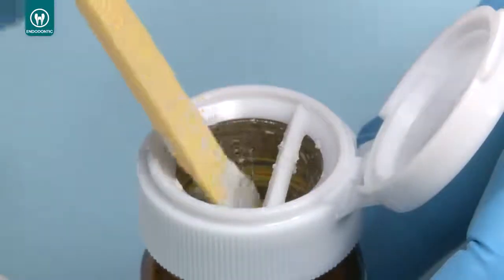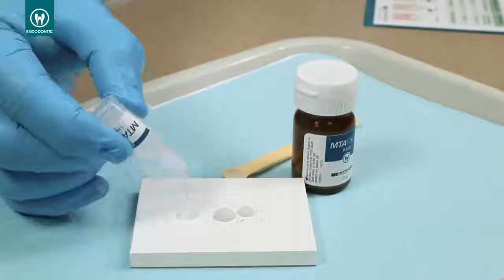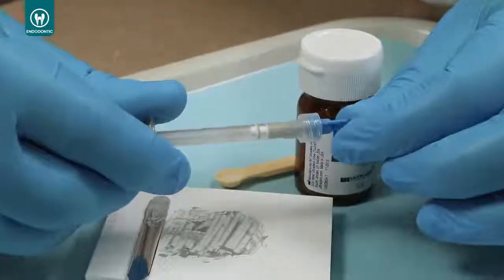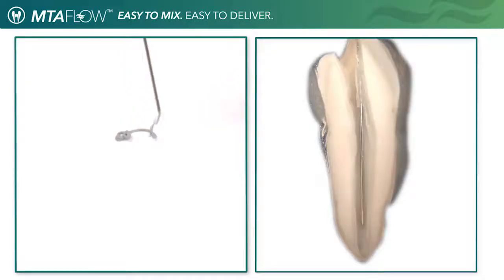Using MTA Flow is easy. Simply measure the appropriate amount of MTA powder and gel needed depending on the procedure. Mix to a smooth consistency. Insert the mixed MTA Flow into the back of the skinny syringe. Reinsert the plunger and choose the desired tip needed.